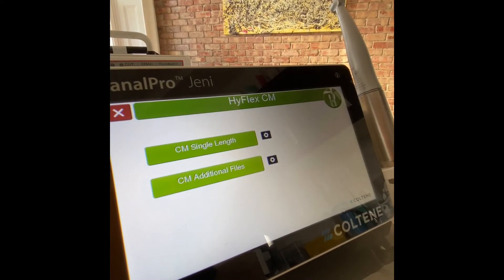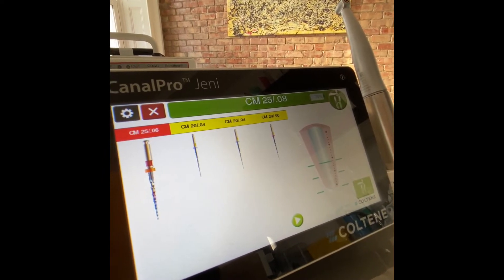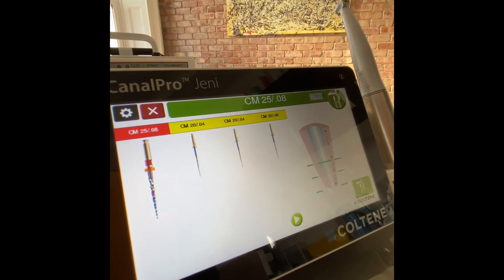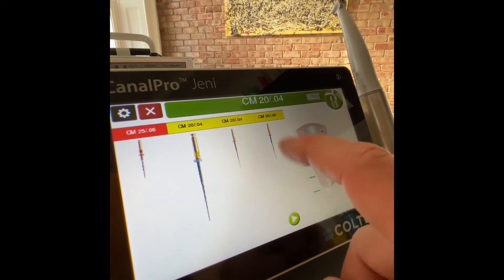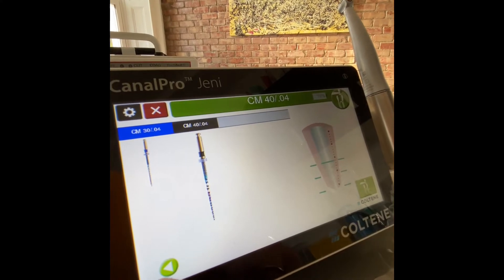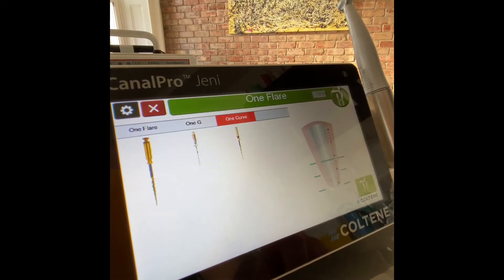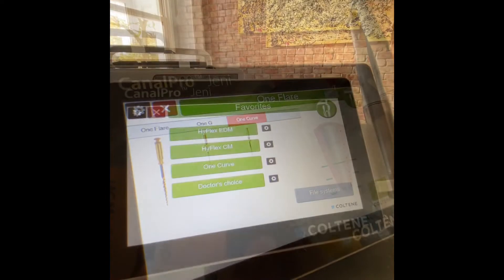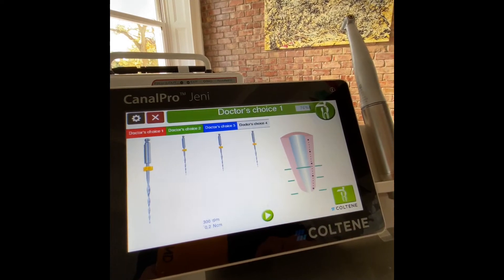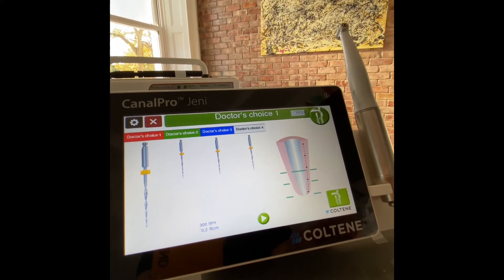This is HyFlex CM — controlled memory — the file that has been out since 2011, my best choice, my favourite for difficult canals. This fits into different files, and there is also One Curve. There is also the doctor's choice, where you can choose your own settings for any favourite file. Jeni is an open system.